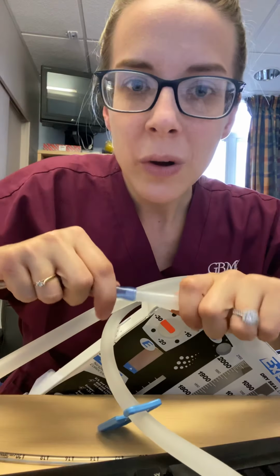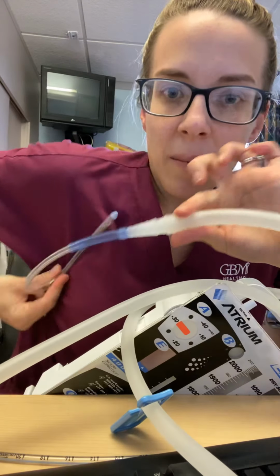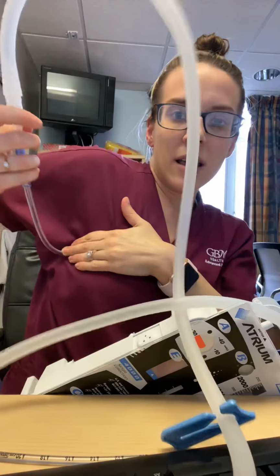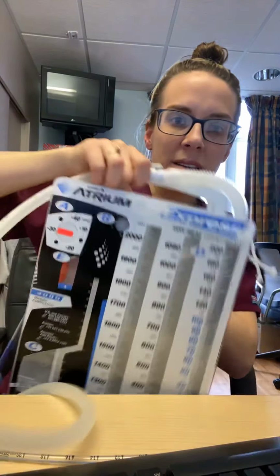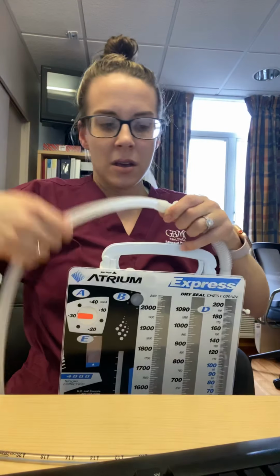You do what you feel comfortable with and what you think is best for the patient, but this is how it will look. You'll see this coming out of this. You won't see any of this. You'll see this coming out of the skin. This is now connected to your drainage box. Okay? All right.